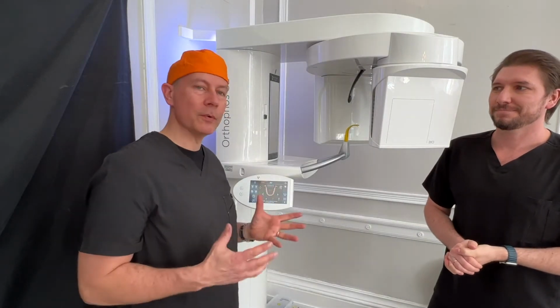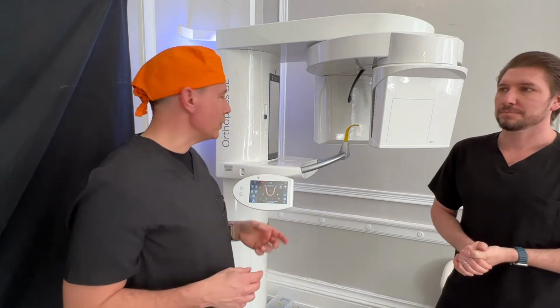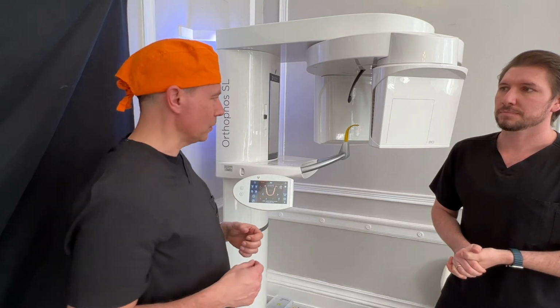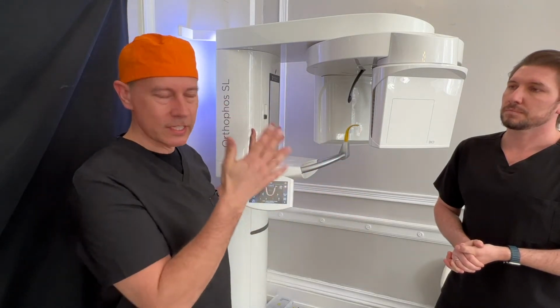Byte tutorial. Today we're going to look at setting up an OPG on your CBCT or OPG machine. Obviously, machines do vary a little bit. We're using the Orthophos SL here, but the principle is the same for all of them. In an OPG machine like this, you have the camera and a rotating head. It moves all the way around, and that's how we get all the slices done.